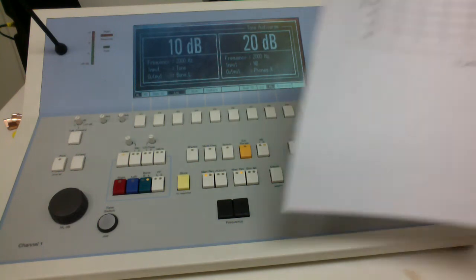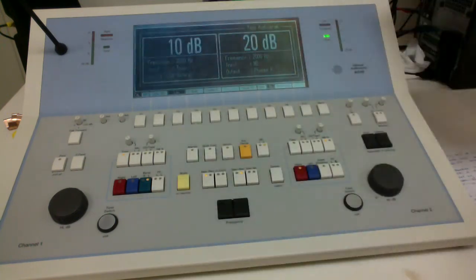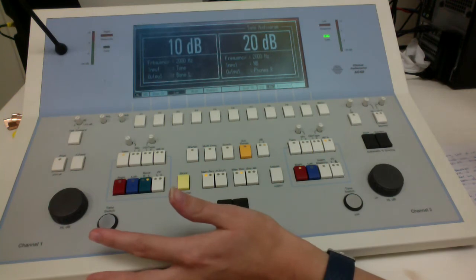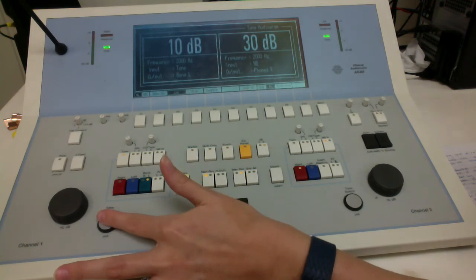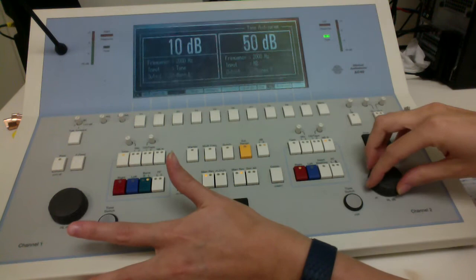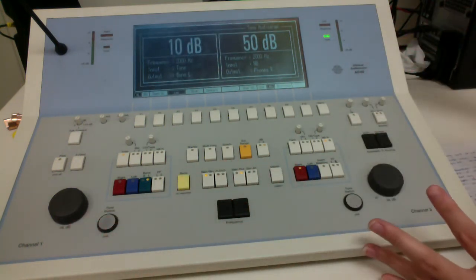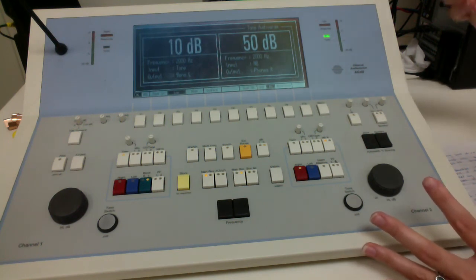If you look back at that, we would obviously also need to be doing bone conduction masking for 1000 as well, but with this video, we're just going to talk about 2000. So the procedure is exactly the same. You present the tone, and if they hear it, increase the masker by 10. Present again. If they hear it, increase it again, present again. You would keep increasing it by 10 until you get a 30 dB plateau.